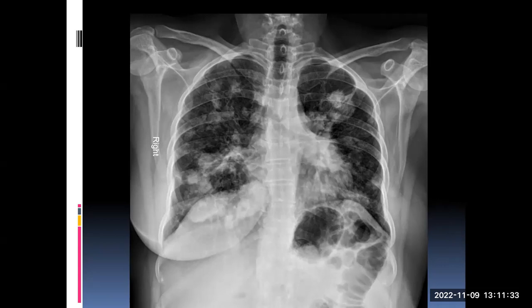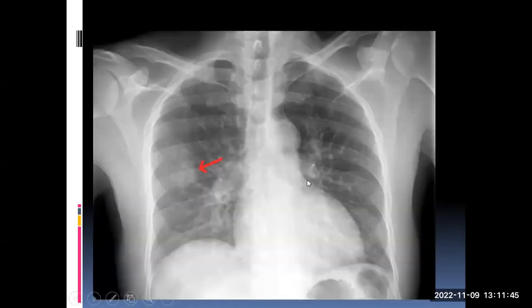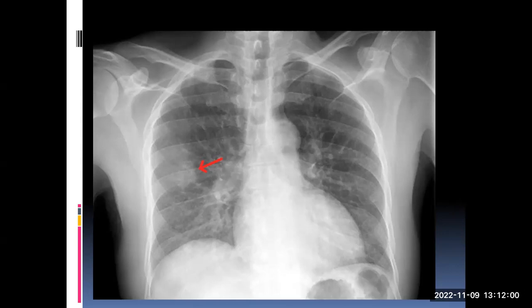This kind of X-ray tells you a story even without the history: we can say there are multiple cannonball metastases bilaterally in the lungs. When you look carefully you can see the breast on one side but not the other — so you know the patient has undergone a mastectomy and is now presenting with recurrence. In the correct clinical setting, a swollen pulmonary artery with a wedge-shaped consolidation — Hamptons hump — in a postpartum mother with shortness of breath and tachycardia strongly suggests pulmonary embolism. The embolus sits in the artery making it denser and bigger, and the wedge is the area of lung infarct. These kinds of X-rays need good clinical correlation.